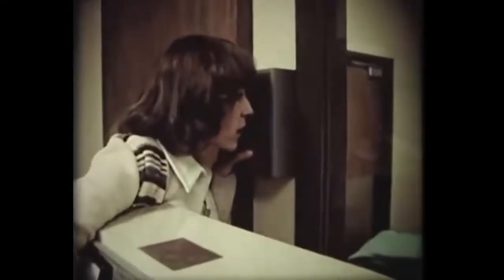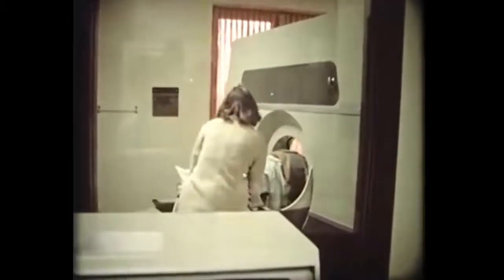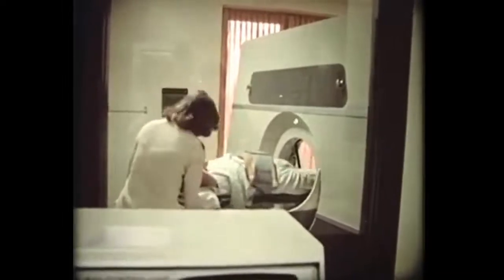These included the Mallinckrodt Institute, headed by Dr. Ron Evans. Well, we did the first patient in the United States in October of 1975, which turned out to be a very exciting one. We felt from the beginning that the question of medical versus surgical jaundice, the patient who has yellow jaundice who comes in, many of those have hepatitis. It's a disease of the liver itself, in which surgery doesn't help. That decision is very difficult to be made, and we felt CT could do it.